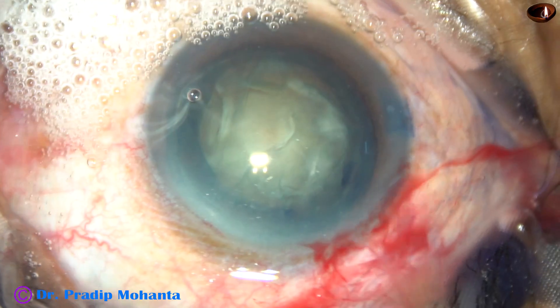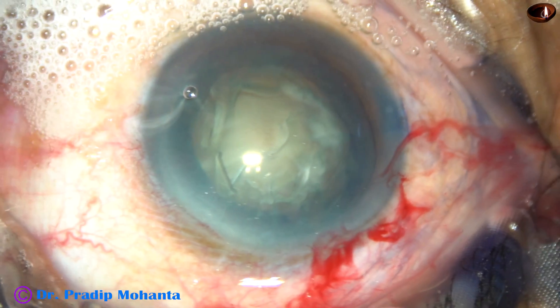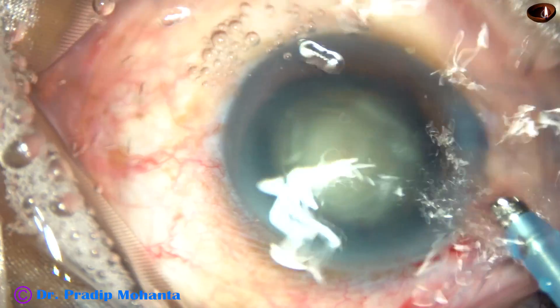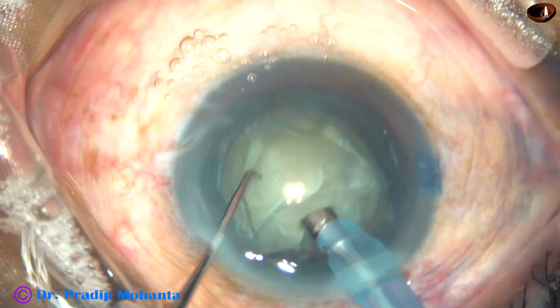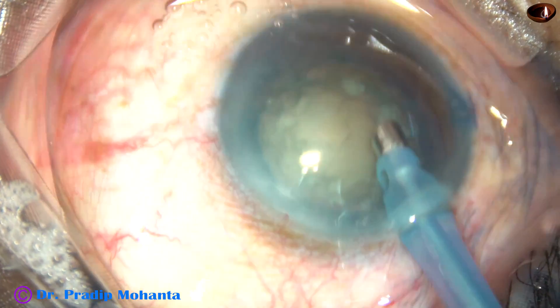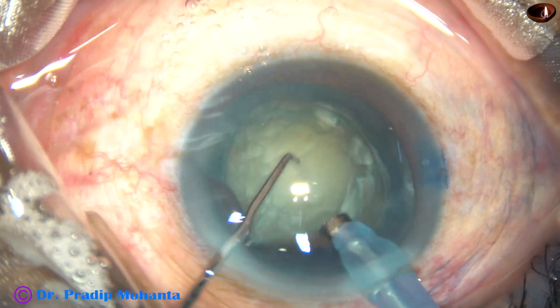By this time, hydrodissection has been done and the nucleus has been mobilized. Now inject viscoelastic substance — this is 2% HPMC. Now introduce the tip of the FACO handpiece. You are going to make two trenches which are at 90 degrees to each other, so you are going to make a plus sign. Remove some superficial cortical lens matter, then turn the handpiece, make the bevel off, and now start sculpting.